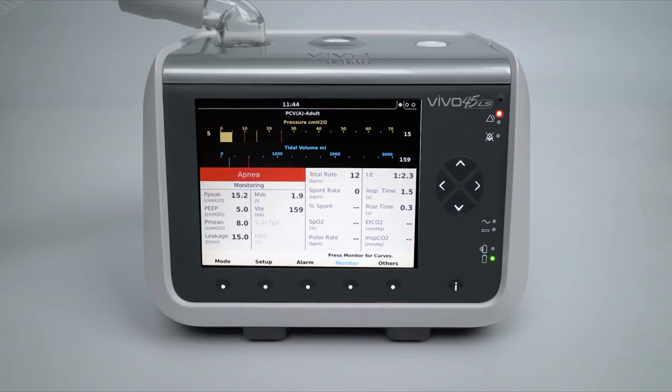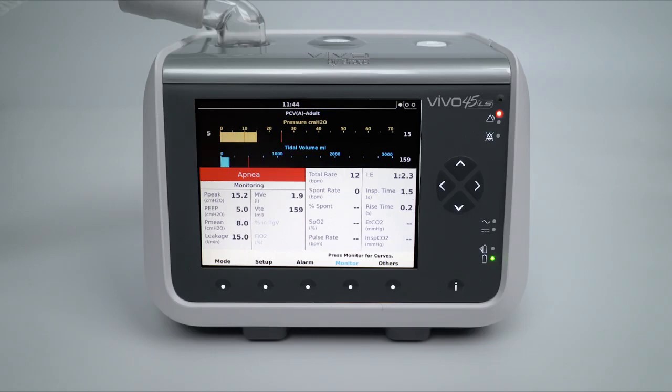An activated alarm will be indicated by an alarm message in the monitoring screen, alarm warning LEDs, as well as an audible signal.